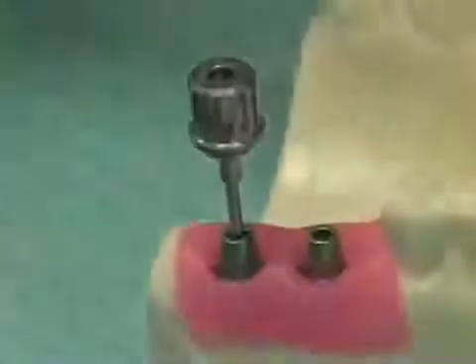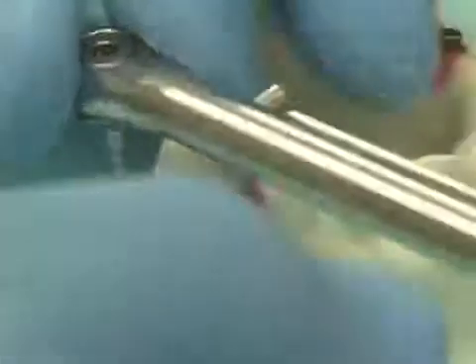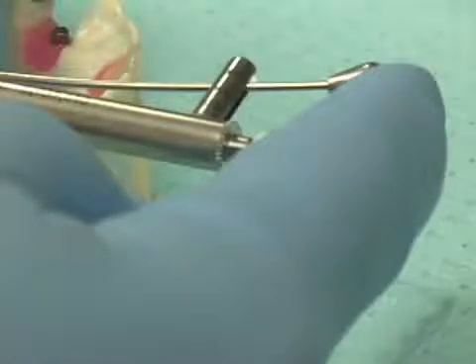And here again, we take our torque driver. The torque driver fits on this just like it did the other. We now go ahead and start torquing this until, when we look at our torque wrench, we have 35 Newton centimeters of torque, so that we know this is then torqued to manufacturer's specifications.